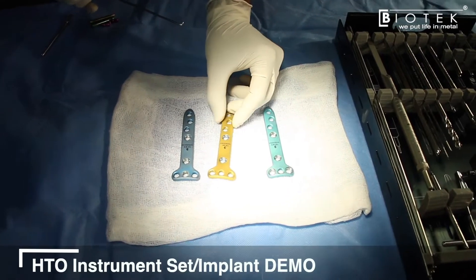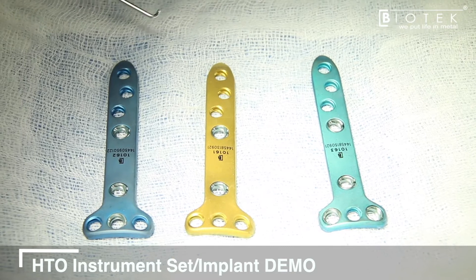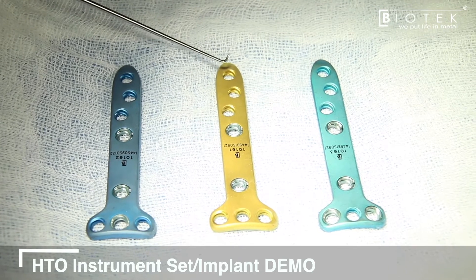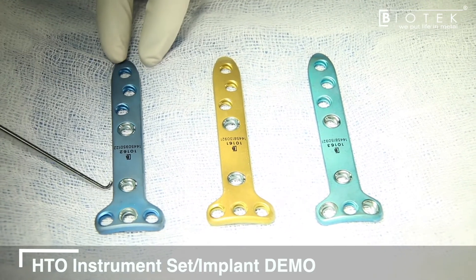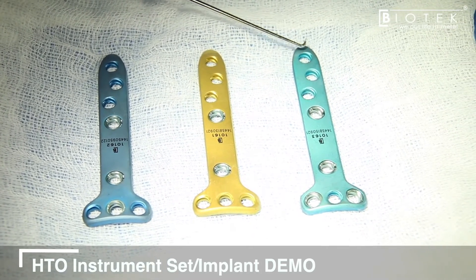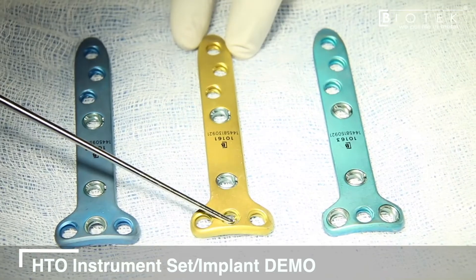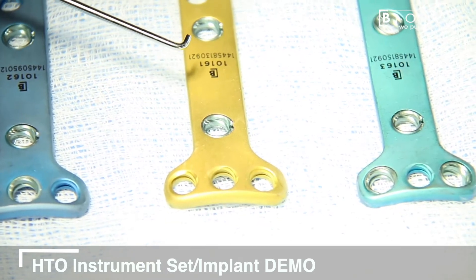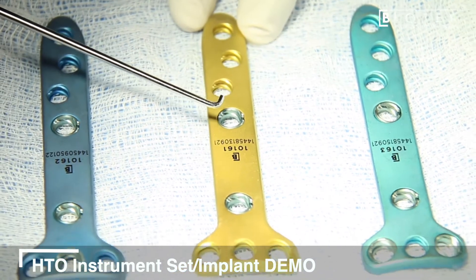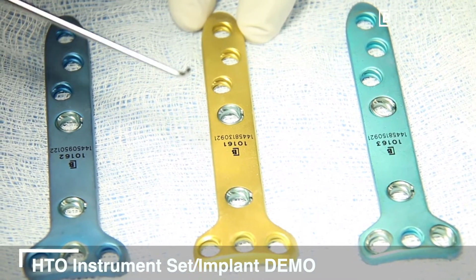We have three different kinds of implants here — locking fixed angle stable implants. This is the basic HTO or high tibial osteotomy plate, and there are two variations. The basic Biofix NP plate has four screws which go in the proximal segment of the osteotomy, called the A, B, C, and D screws. For the distal end, we have hole numbers one, two, three, and four.